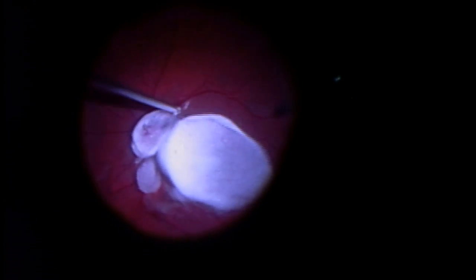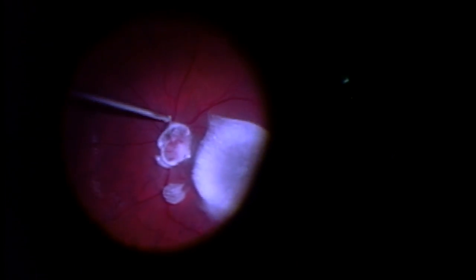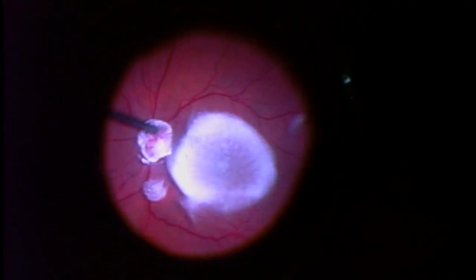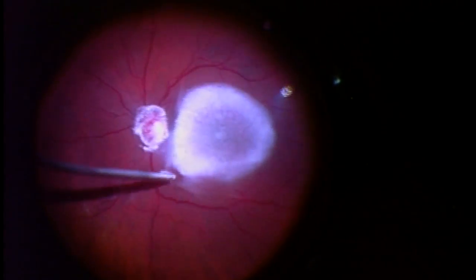The steroid mixes very well with the vitreous gel, and as you can see here, I can kind of see where this transparent jelly is firmly attached to the back of the retina. Once I gently start, what I try to do is gently find a small place where a separation can occur, and then I enlarge this area of separation to create the posterior vitreous detachment.